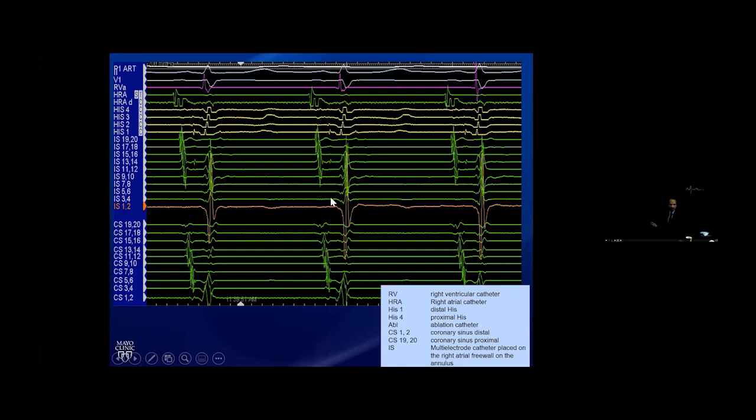No retrograde conduction through these type of pathways. So the target is something else. Another very important scenario is when we have early activation at this site during a whole plethora of SVT types.